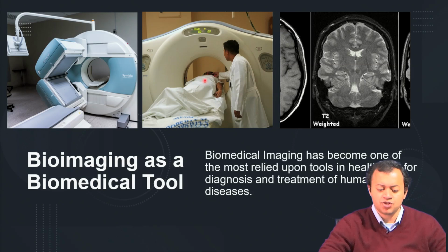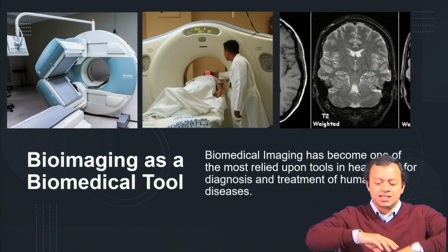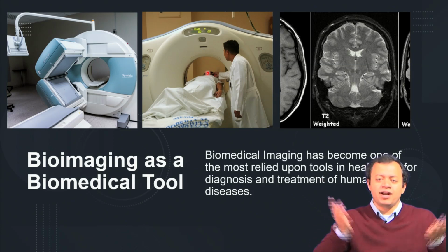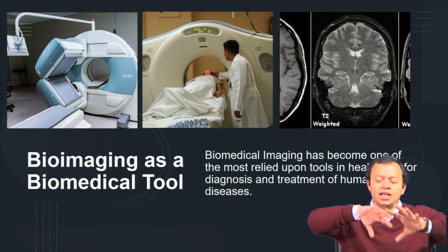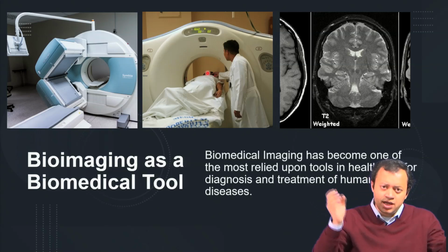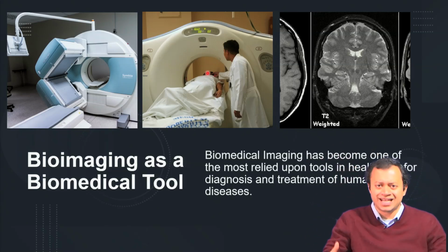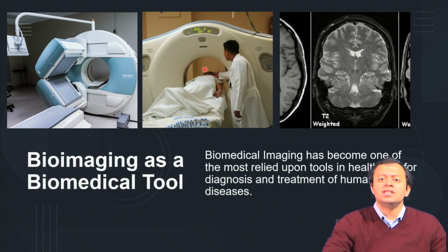You can see a faint red line going through it. So, this slice, that slice, different X-rays at different angles, and then by taking each different image from different angles, you reconstruct a whole three-dimensional image. So, that is basically CT scan, computed tomography scan.